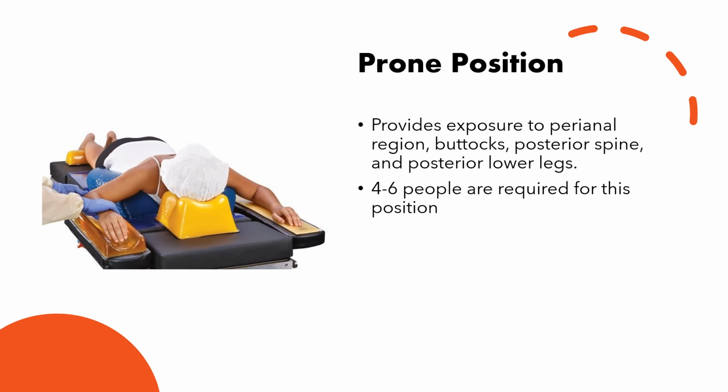Again, the patient is placed face down in the hollow centered foam rest or gel rest, and this is to protect the eyes, ears, and facial nerves from injury.